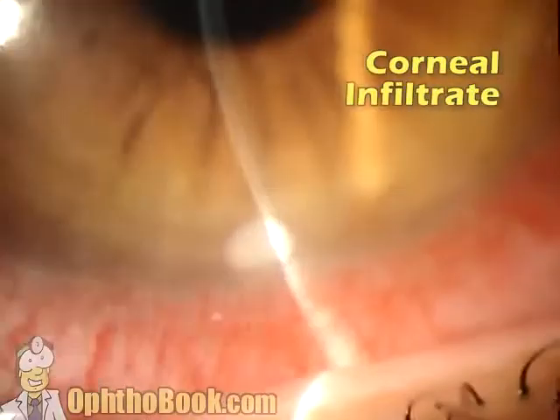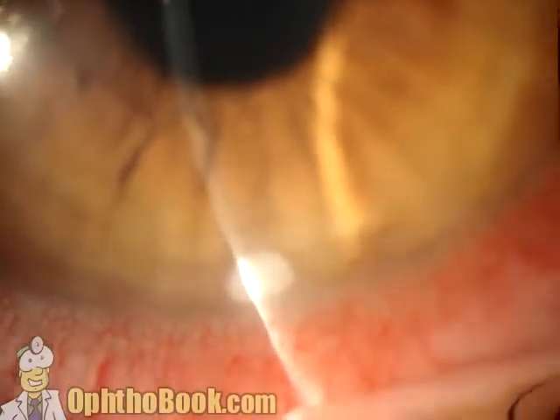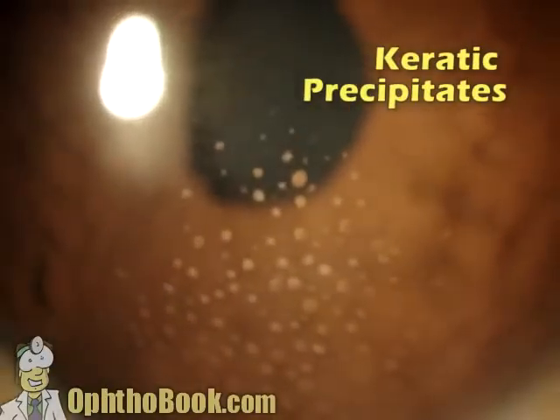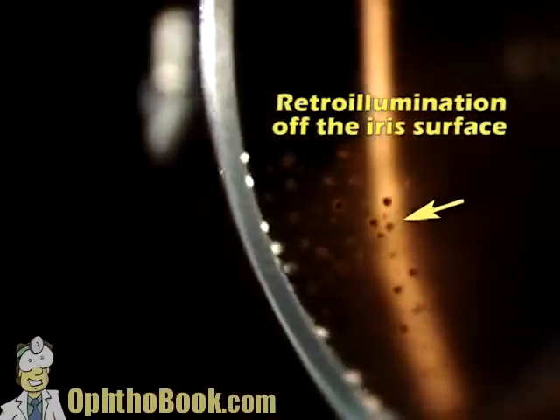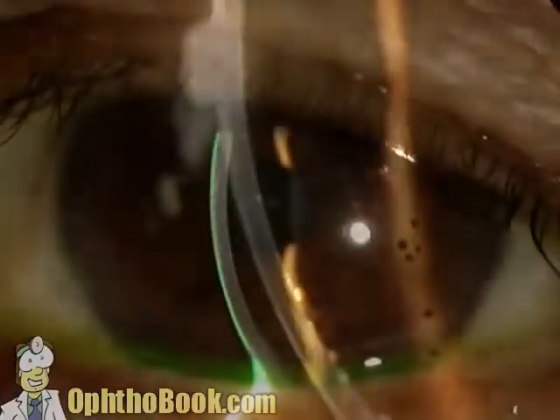This is something we see a little bit more often. This is a corneal infiltrate, probably related to contact lens use. And it's on the front of the cornea. You can kind of tell just the way that it lights up. Very amenable to antibiotics. This is KP splattered on the back of the cornea, and we know it's on the back of the cornea because we can use our slit beam once again. You can see how it lights up on the back surface, and you can even use retroillumination on the iris to see those dark spots by looking at the bright iris as a background.